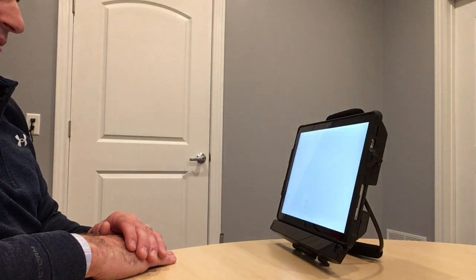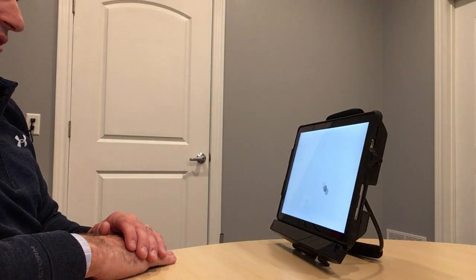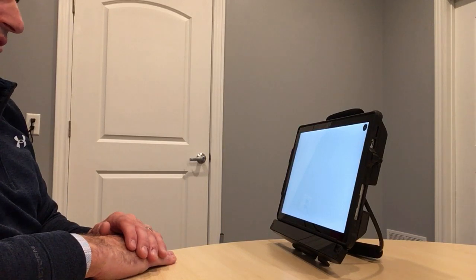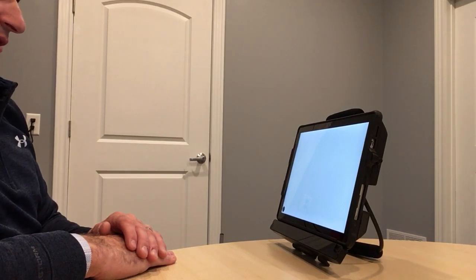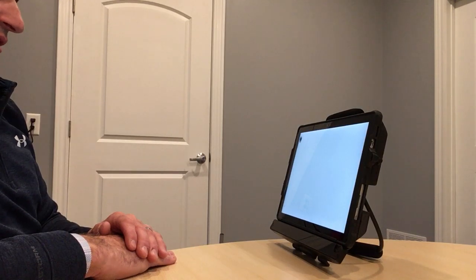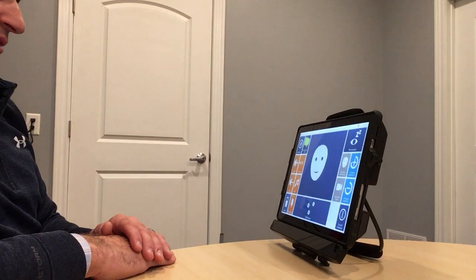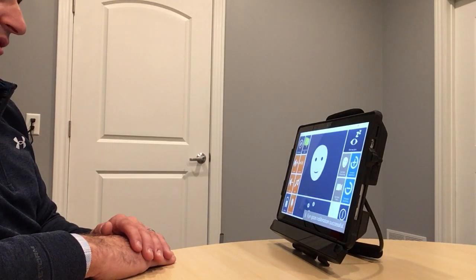So now I'm going to go through a calibration and all I'm doing is watching that dot as it's shrinking. The computer is looking at how much my eyes move from left to right and then using that distance to calculate where I might be looking.